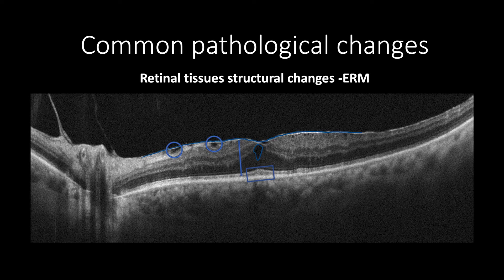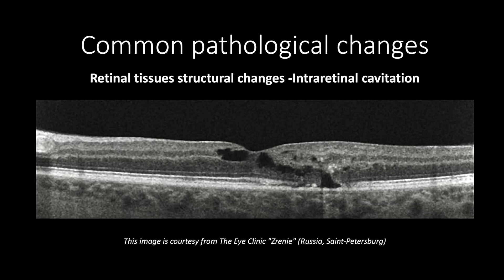Intra-retinal cavitation may appear as intra-retinal cystic changes without an increase in retinal thickness. Intra-retinal cavitation is not formed due to intra-retinal tissue fluid accumulation. Instead, cavitations are formed due to degenerative processes such as in macular telangiectasia type 2 or age-related macular degeneration.